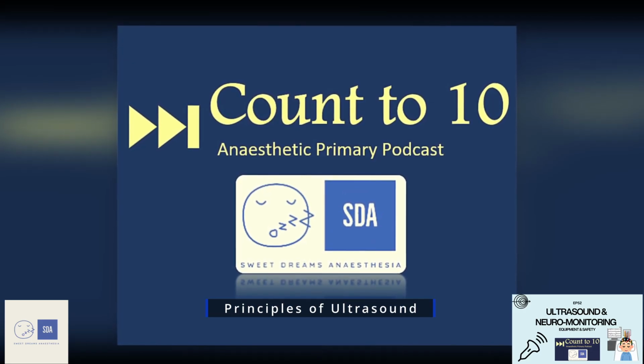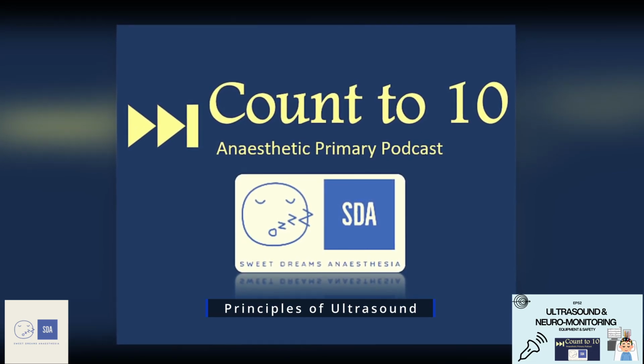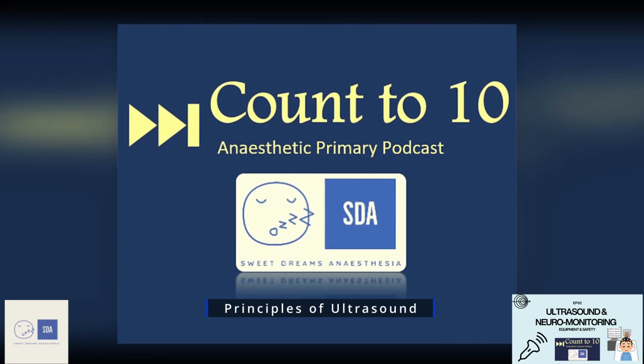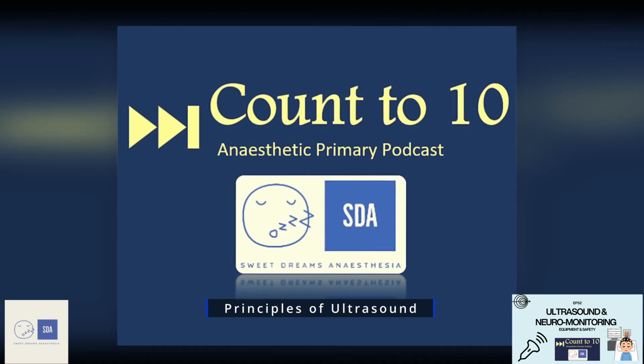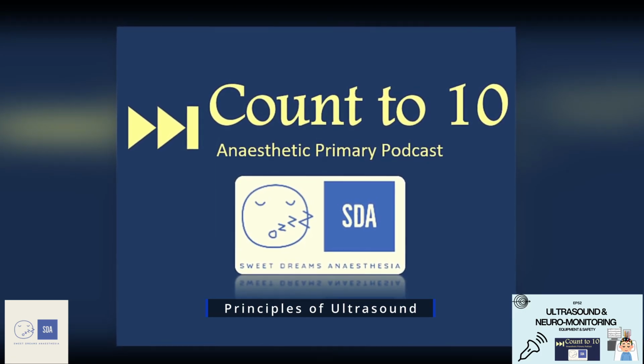Within an ultrasound probe, what happens is we layer this probe with multiple piezoelectric crystals, roughly in the realms of hundreds to thousands. We apply a small voltage to these crystals, causing them to deform and release energy in the form of a mechanical pressure wave, aka a sound wave. That sound wave then travels across different tissue mediums and then returns back to those same piezoelectric crystals, causing them to deform and this time release a voltage which the ultrasound machine interprets as an image. That's the crux of ultrasound image generation.